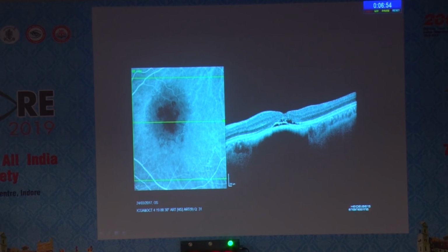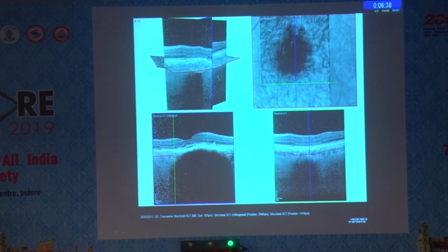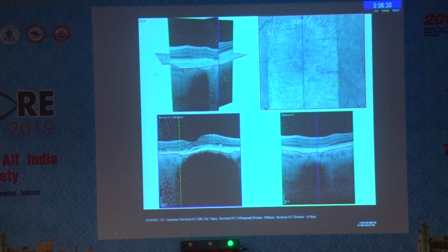Before this bulk motion artifact technology came in, people were getting all sorts of images when the patient moves their head. It's basically looking at phase difference. So I would put it slightly on the back burner. Like I said, it's still version 2. But this is why this is not leaking on the angiogram. I would like to see the fluorescein to see if there's leakage. Unfortunately, we're doing only advanced imaging today. Old is gold.